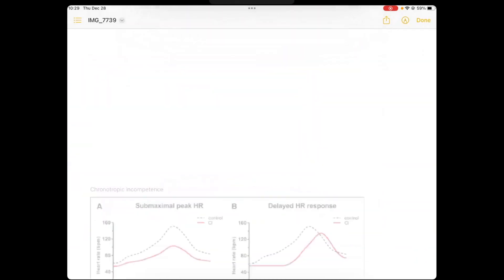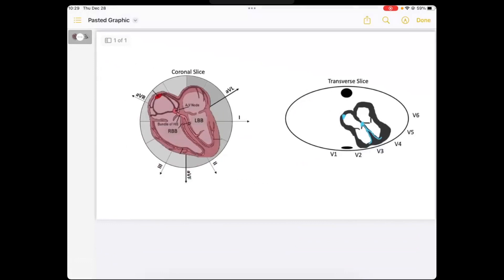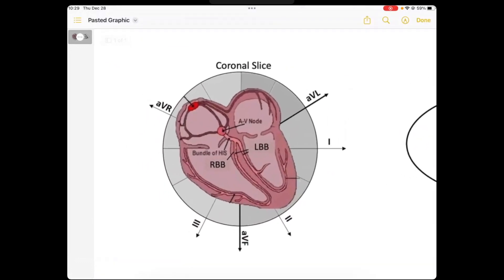And if those P waves are driving the QRS complex, then I can say it's a sinus rhythm. Why do I say that I look at those leads? Well, look at my coronal slice here, which is my limb leads. These are my limb leads here. And you see my sinus node is located. This is my sinus node.